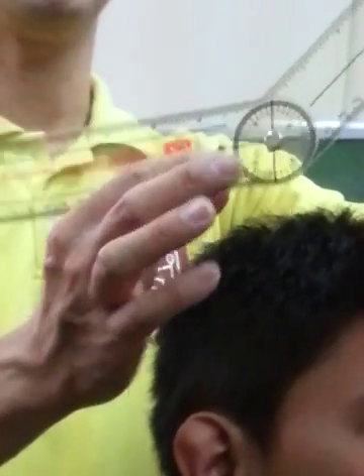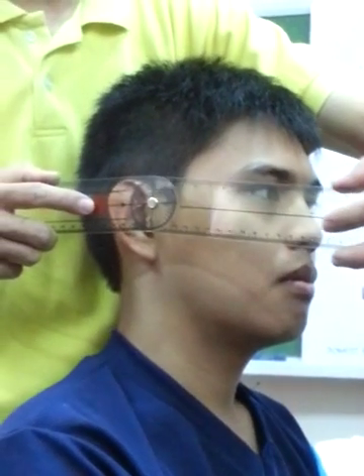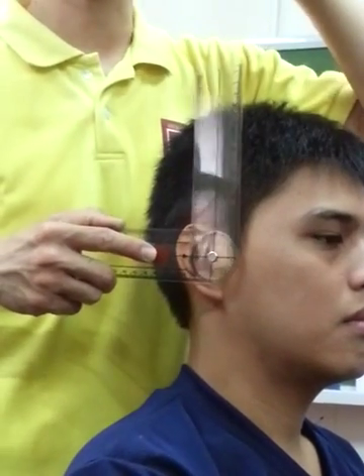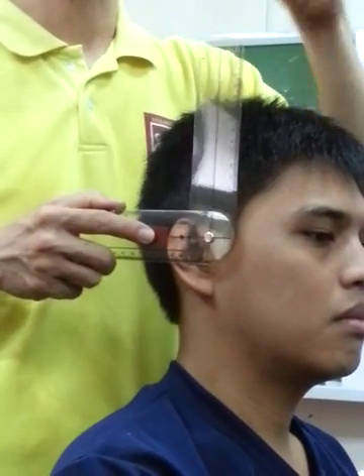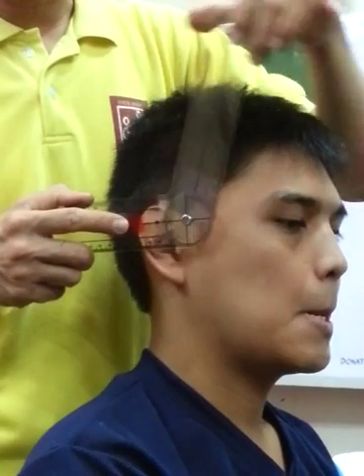This one with the arrow is now the distal or moving arm. The stationary arm, as mentioned, is either parallel to the ground — in this position — or perpendicular to the ground — in this position. It should be stationary and not move. That is your basis for the stationary arm — either perpendicular or parallel.